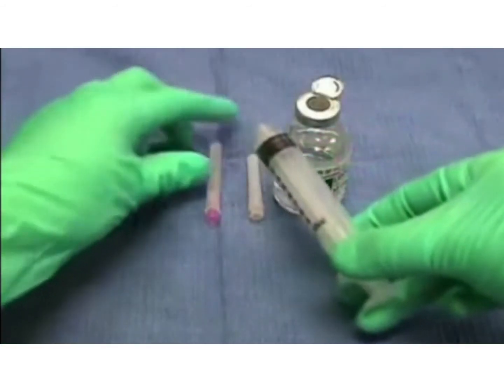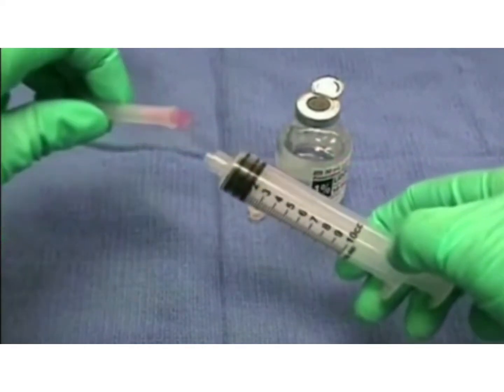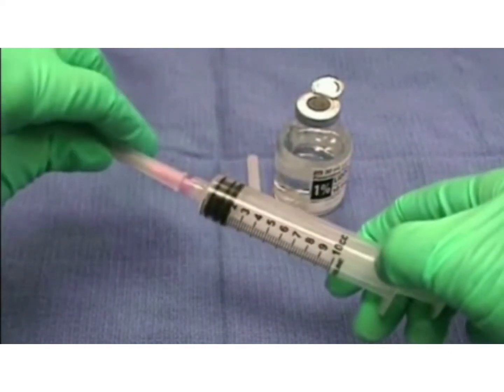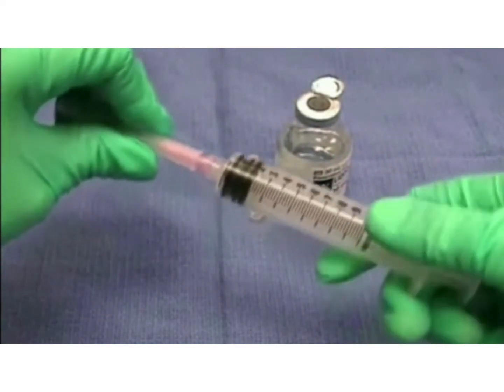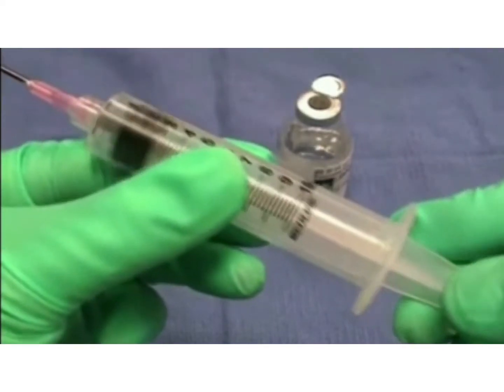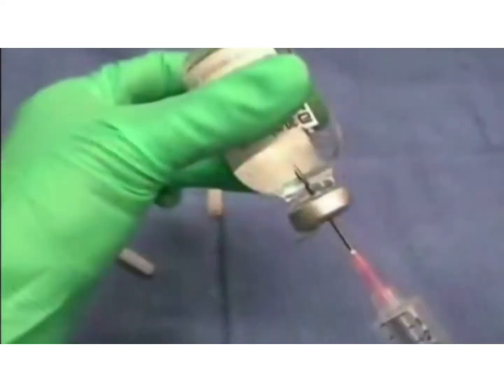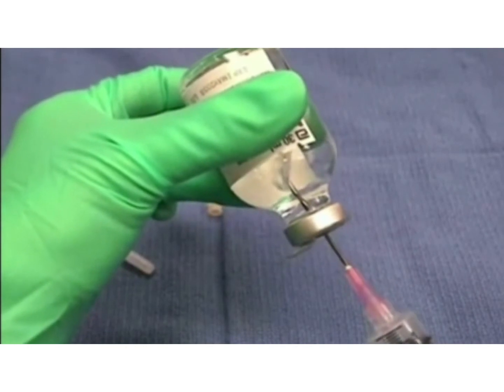Local anesthesia in field block should be given in a circumscribed manner. To draw your anesthesia into the syringe, attach the large bore needle to your syringe and aspirate 3 to 5 cc of air. Inject the air into the anesthetic bottle before withdrawing the anesthetic.